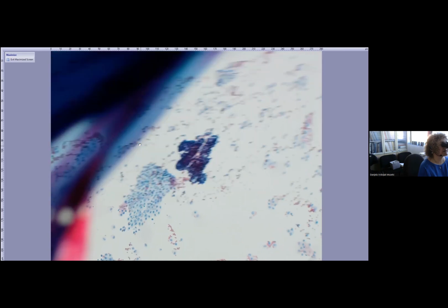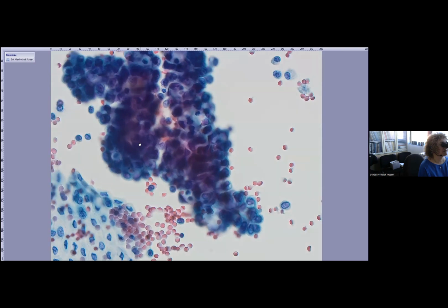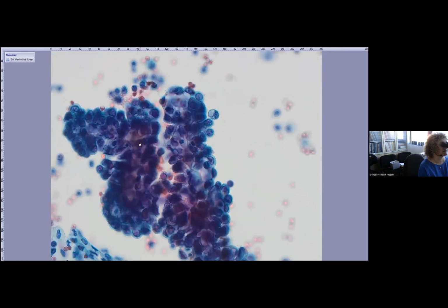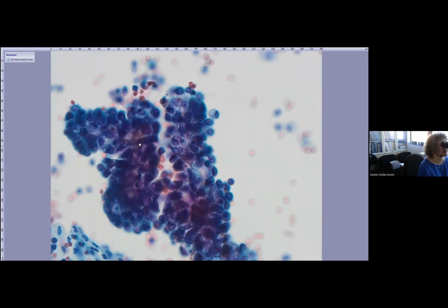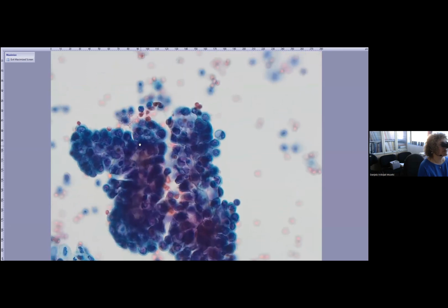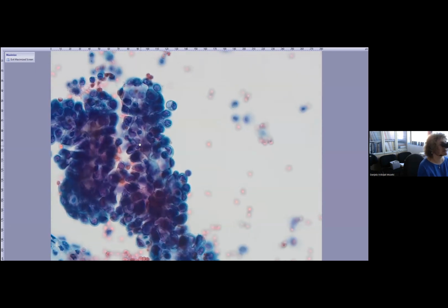Here, this is the best, I think, to show you the cells originating from the borderline serous tumor. It was confirmed later on the histology. So this is the situation in which we will wait for the histology and then correlate, and then yes, okay, we have some atypical cells that can correlate with the diagnosis. So this is it, papillary cluster with small cells, small nucleoli, vacuolization.